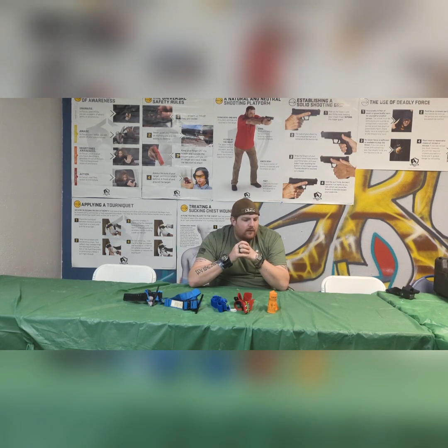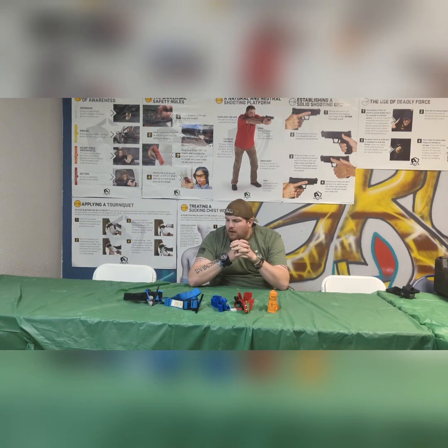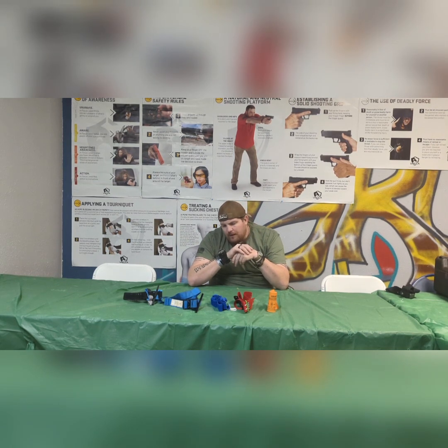When I'm doing tactical training and I have my plate carrier and all my gear and I'm doing all that tactical cool stuff, I carry a minimum of 4 tourniquets, one for each limb or for somebody, but also in case I need backups. And we'll talk about that in a later video about using multiple tourniquets on a limb.